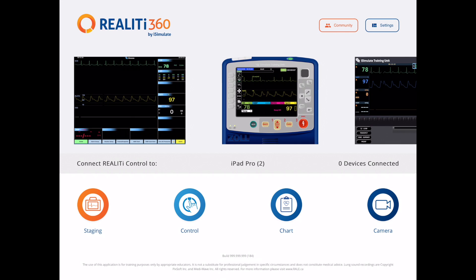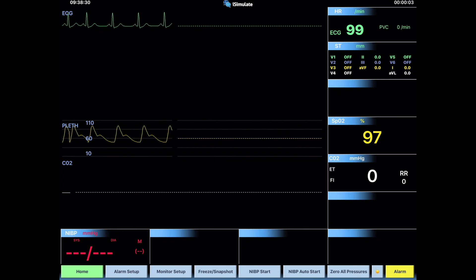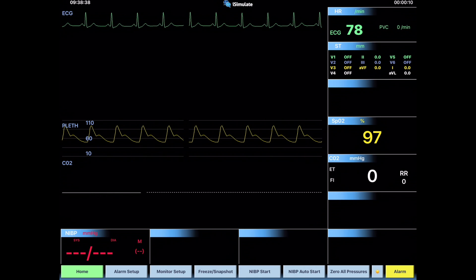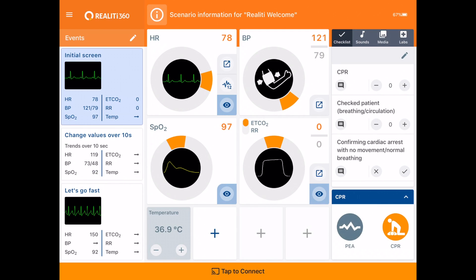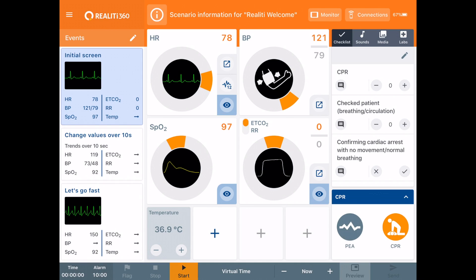The other thing with this new screen is that you can start things off by just tapping on one of these screens. I'm just going to tap on the first one here and it immediately starts into a demo mode. Then if you want to connect the control iPad to it, just tap on Control, then tap to connect — you'll see the iPad to connect to, and we'll connect and we're immediately running that screen.